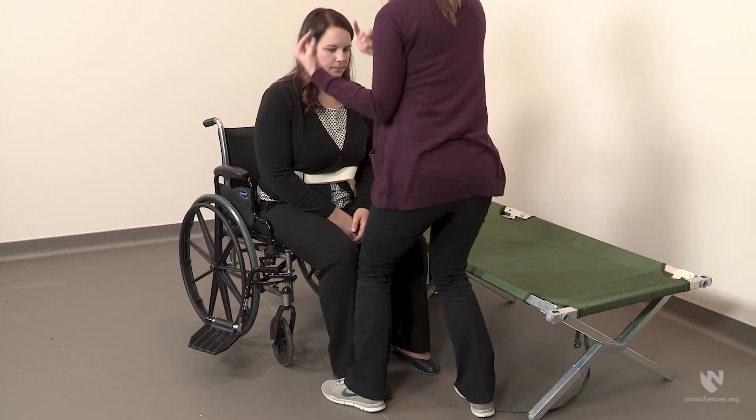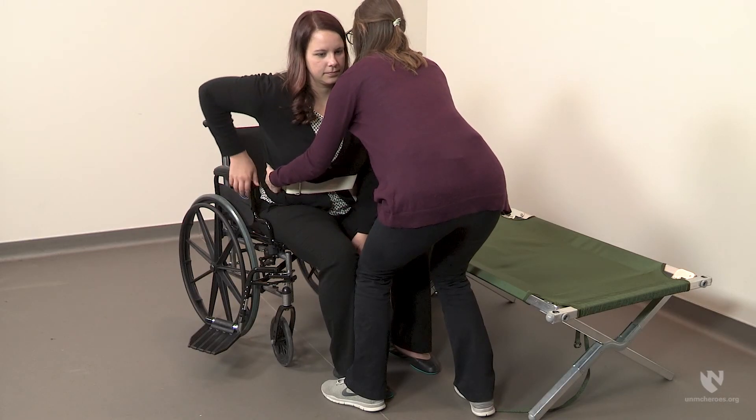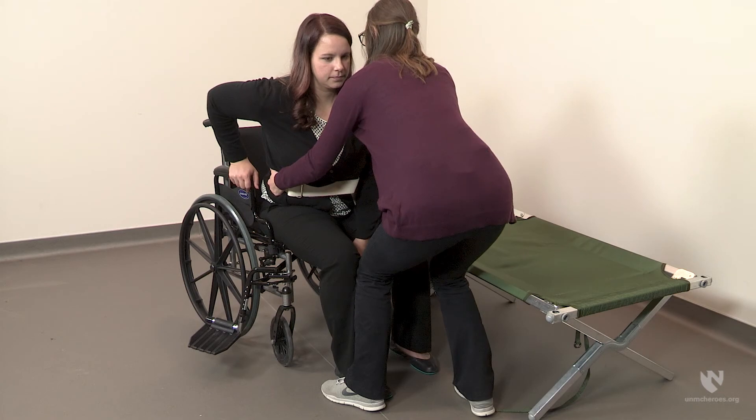Have the individual lean forward and away from the cot. This will seem backwards but will actually help unweight her hips and pivot towards the cot. Position yourself very close to the individual in order to avoid straining or injury. Instruct the individual to push through her arms using the remaining armrest and use her legs as much as possible to help you move during the transfer. With a firm hold on the gait belt, shift your weight onto your back foot and lift the individual upward and forward so her hips just barely lift off the wheelchair.